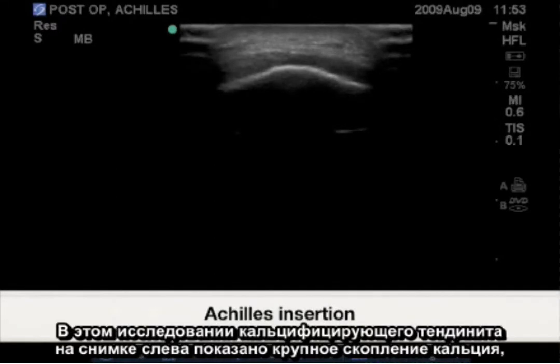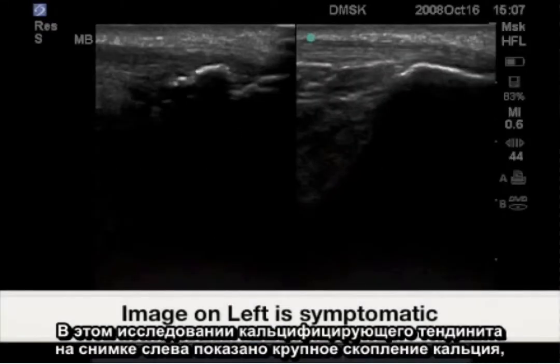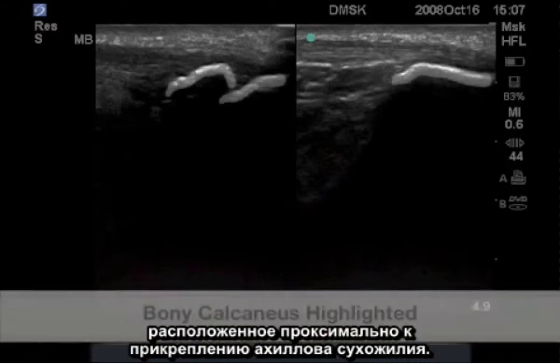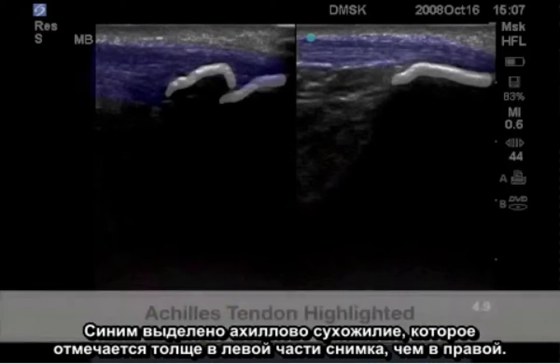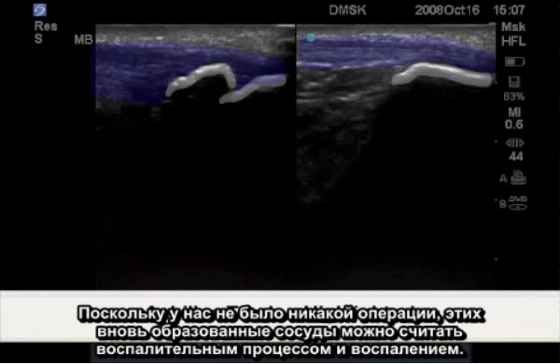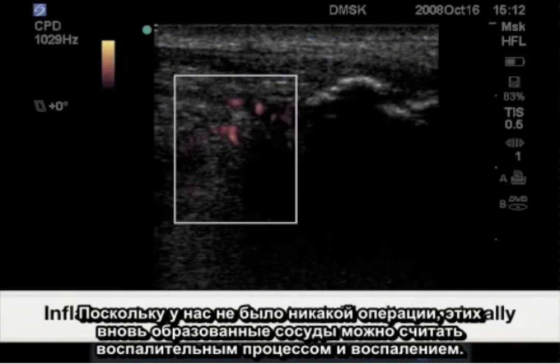In this calcific tendonitis study, the image on the left shows a large calculus deposit proximal to the insertion of the Achilles tendon, highlighted in blue, with the Achilles tendon noted thicker on the left image than the right. As there has been no surgery, these neovessels can be considered part of the inflammatory process.